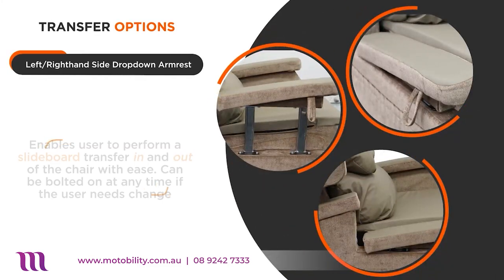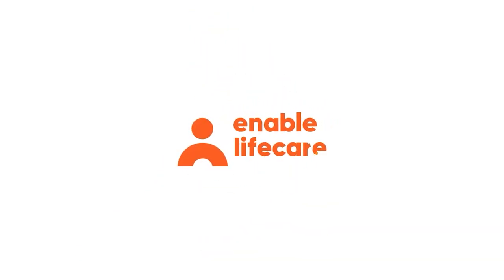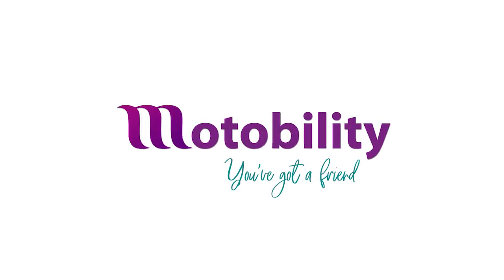To assist the user in and out of the chair, there are also left and right drop-down armrests. So if you are looking for a lift and recline chair with multiple options at a reasonable price, the Configura Comfort is the chair for you. Motability — you've got a friend.